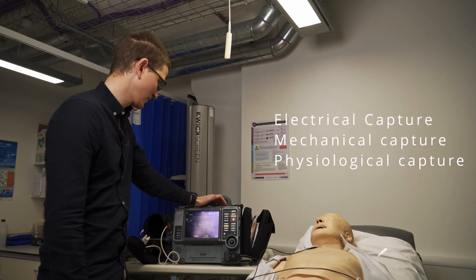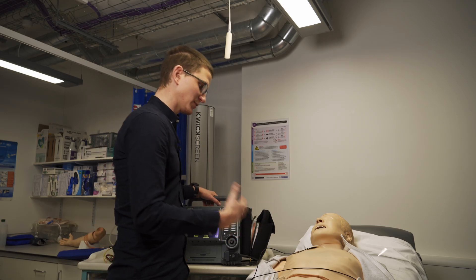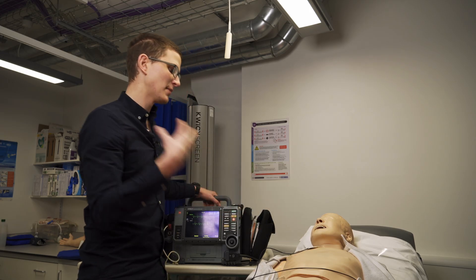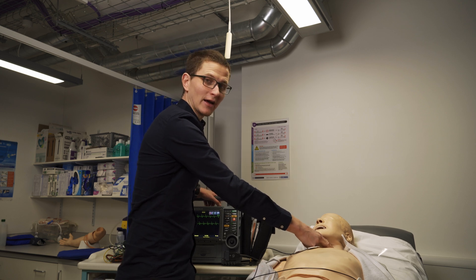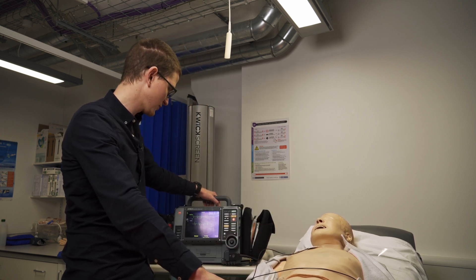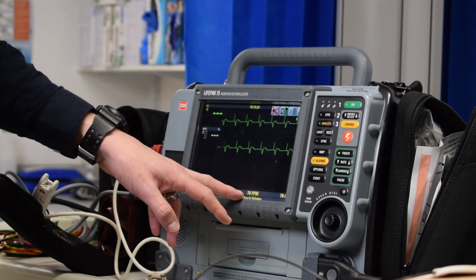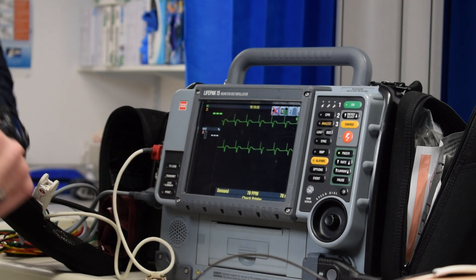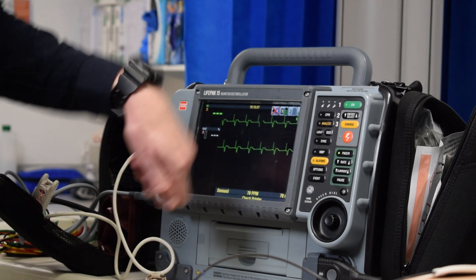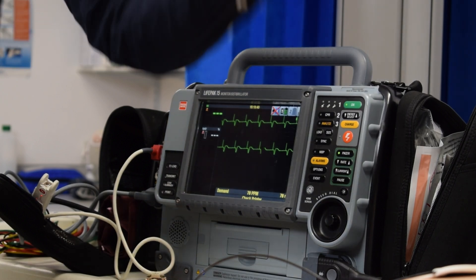Now after each pacing spike I have a QRS, which tells me we have electrical capture. Now we go for mechanical capture. We don't feel for a carotid pulse because the muscular jerking of the chest can sometimes feel like one. Instead we go for a femoral pulse and check whether what we feel there syncs up to what we see on the monitor. If we feel 70 beats matching our set rate, we have mechanical capture.